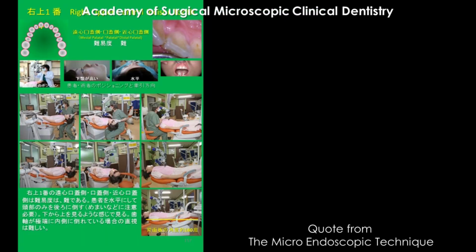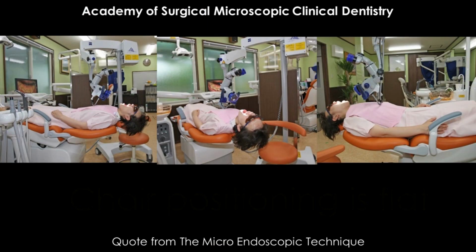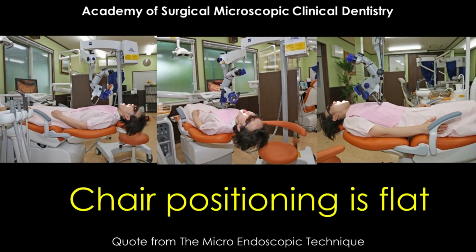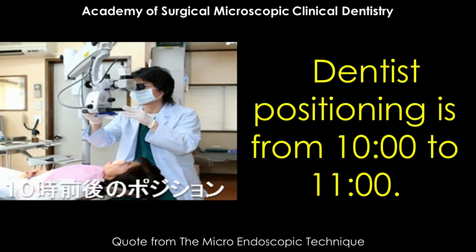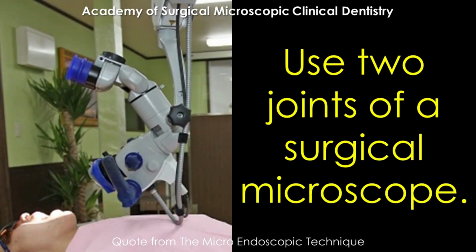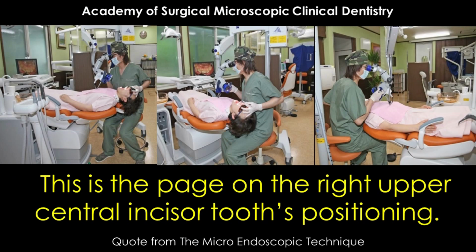This is the page on the right upper central incisor tooth positioning. Chair positioning is flat. Mandible is elevated, face up. Dentist positioning is from 10 o'clock to 11 o'clock. Use two joints of the surgical microscope. As you can see, this is the page on the right upper central incisor tooth positioning.